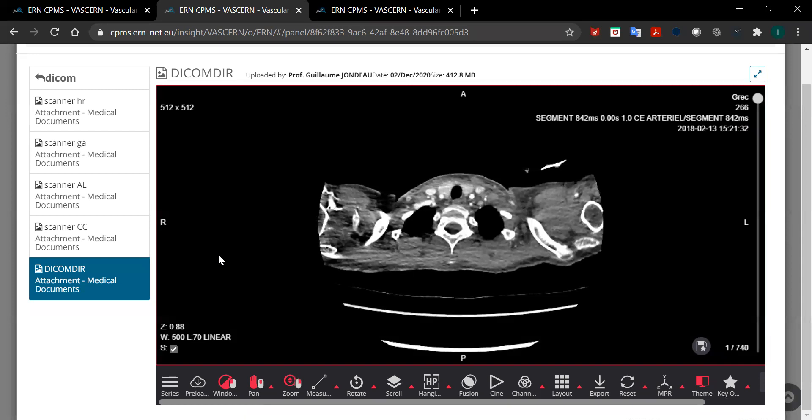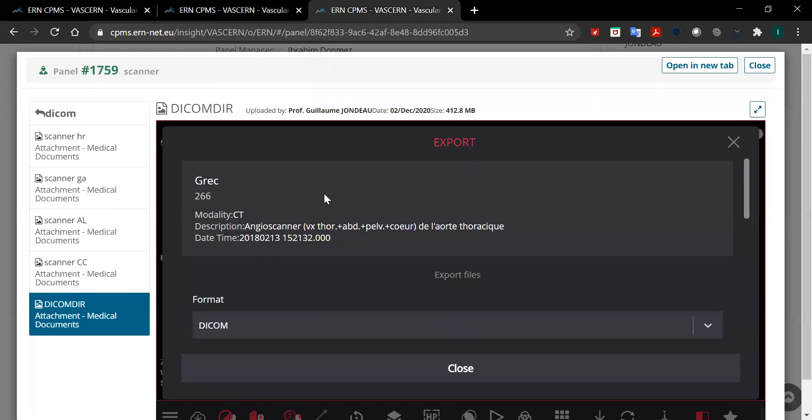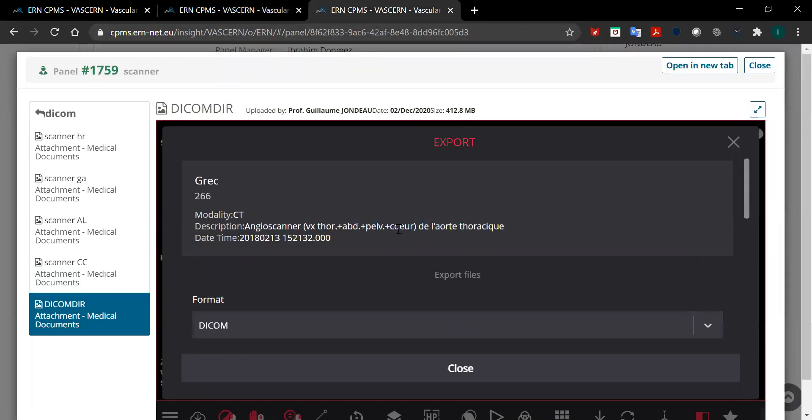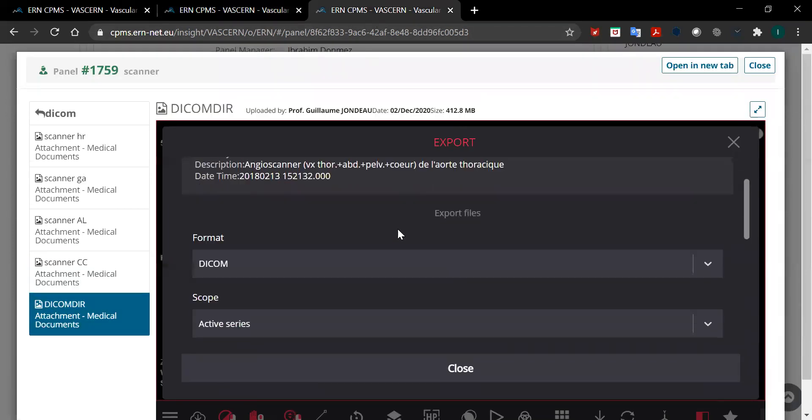Once you've selected your image, you need to click on export here at the bottom. When you click on export it will take you to this page. From this page the last step is to select active series from the scope.